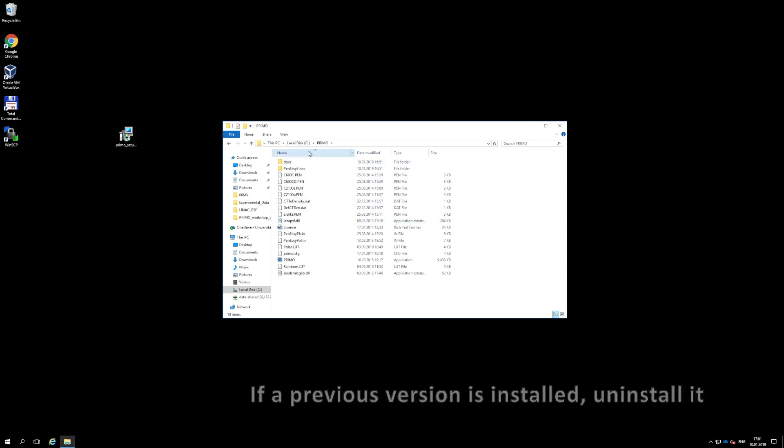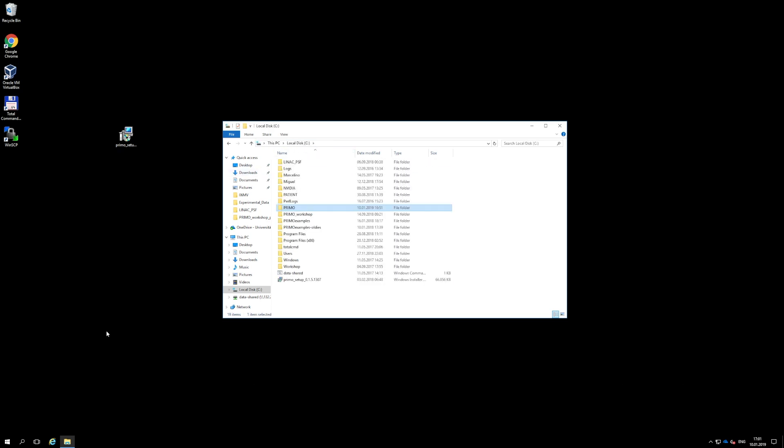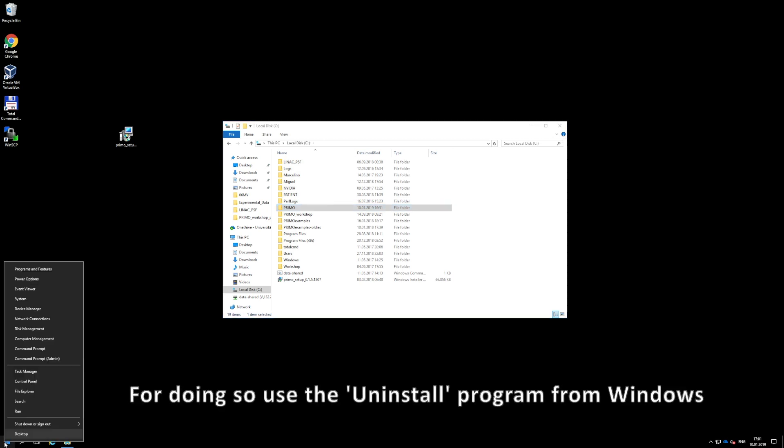To uninstall Primo, use the uninstall program provided by Windows.